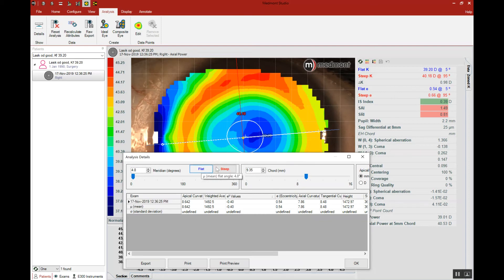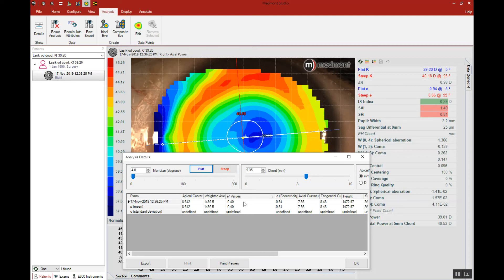Now there may be different values between the flat meridian and the steep meridian. In this case, the steep axis has a much higher E-squared value — it's more oblate than the flat axis. Generally, when your negative E-squared value is greater than 0.25 — in other words, when you have a very oblate surface greater than negative 0.25 — that would indicate that a reverse geometry lens may be called for. A conventional constructed GP lens with steep base curve and flatter peripheral curve system will not be appropriate for this patient. We need a lens that's flattest in the center, steeper in the mid-periphery, and flat as you go out toward the far periphery of the lens. So this is a reverse geometry shape construction.